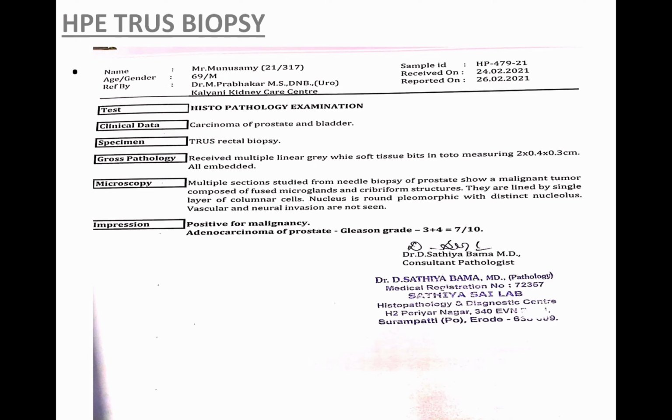Yes. Okay. What is the PSA in this patient? They didn't mention it to me, sir, in the report. I think PSA was 200, sir. Yeah, it was told to you last time. Yeah. So it's a very high PSA. Yes, sir. It's a very high PSA.